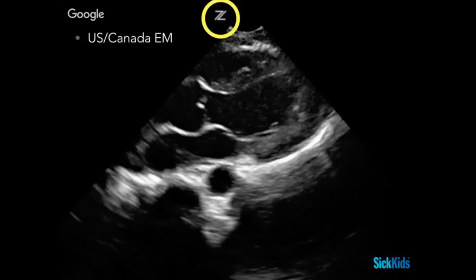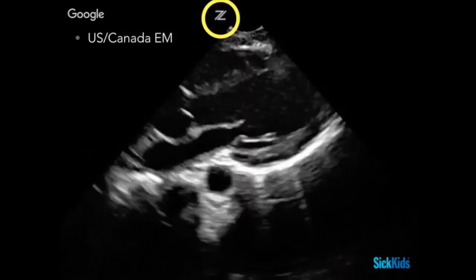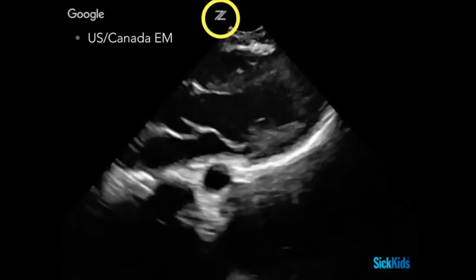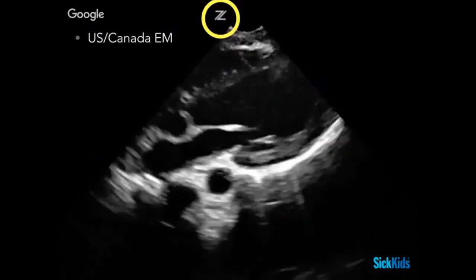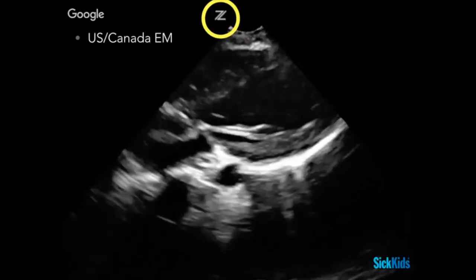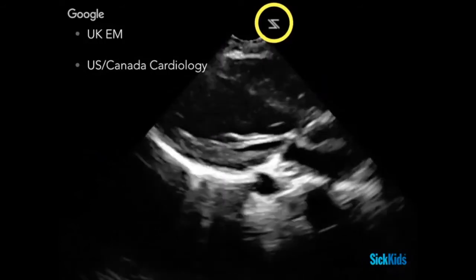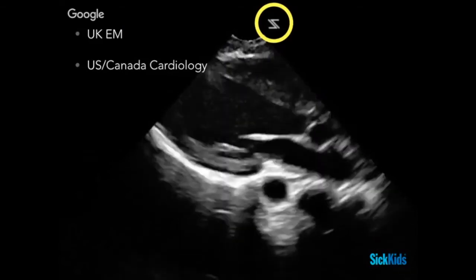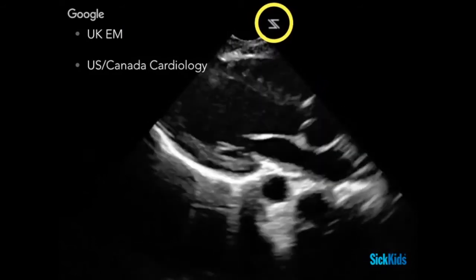This is worth noting not so much for day-to-day practice, but because you'll see videos from around the world or train with people from abroad. The standard US or Canadian EM setup has the probe marker on the left side of the screen correlating with the outflow tract. In contrast, the UK and cardiologists here use the probe marker on the opposite side of the screen, so the view is just flipped — it's literally just flipping the screen.